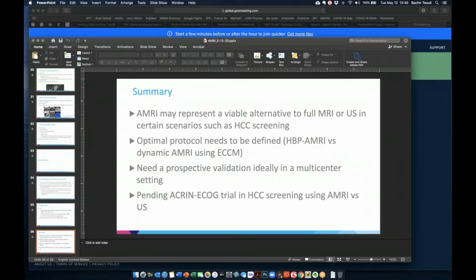Okay. And my second question was, I know you have extrapolated the data from the entire MR studies to get the sensitivity and specificity. Are you guys in real life doing abbreviated MRI for surveillance? And if you are, are you coding and billing it as a separate abbreviated MRI, or are you coding and billing it as the entire abdominal MR?